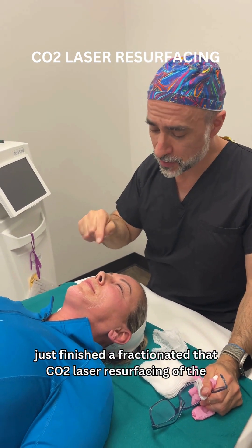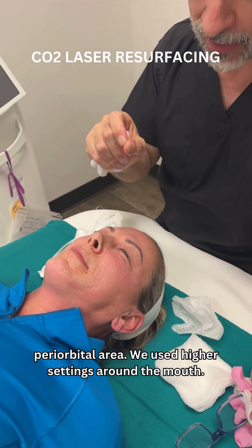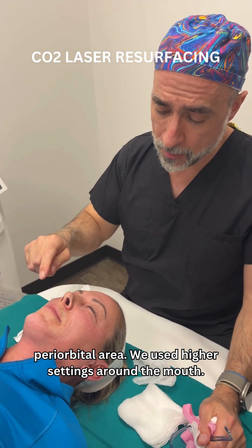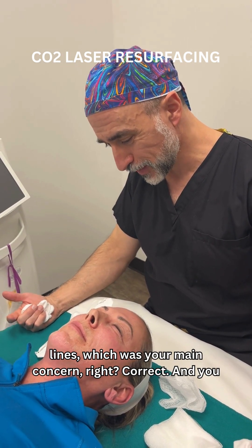We just finished a fractionated CO2 laser resurfacing of the mouth — the perioral area — and the eyelids, the periorbital area. We use higher settings around the mouth; we can use the highest settings around the mouth to treat those smokers lines, which was your main concern, right? Correct.